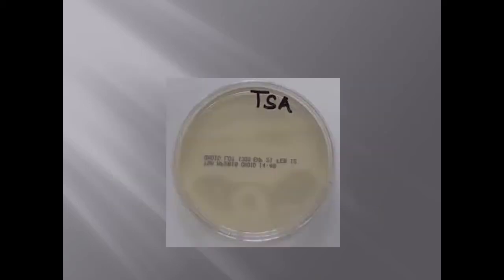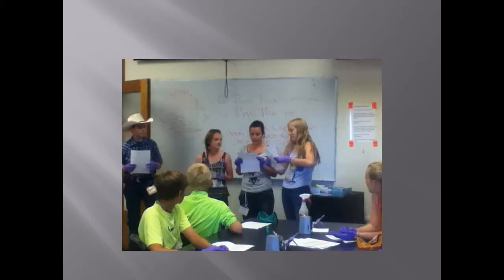Our first swabbing of the 3 dogs, the TSA plates average a growth of 3. The 2 scavenger dogs' plates were both in the normal bacteria streaks with a couple isolated dots. The ranch dog's plate had big clumps of bacteria, meaning it probably had a larger amount of bacterium in its mouth. The second swab we found about the same result, but not as much growth.